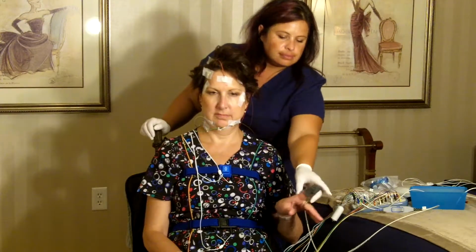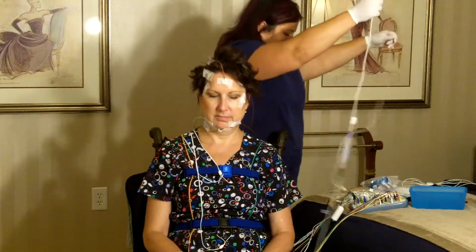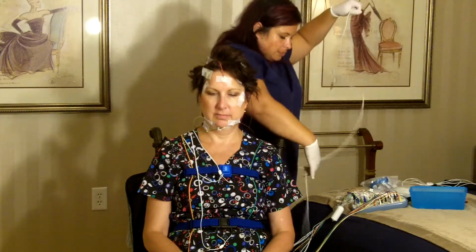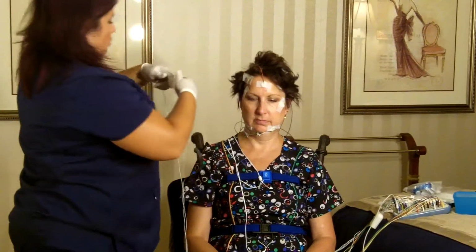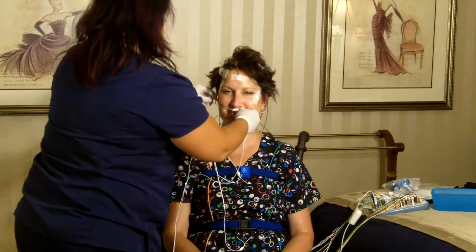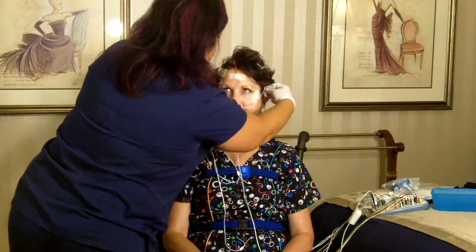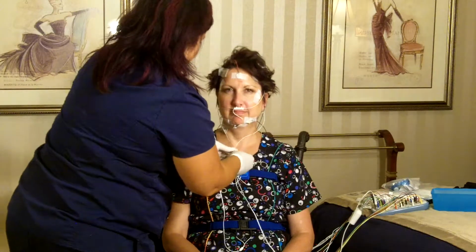A finger monitor is placed to measure the level of oxygen. For best results, refrain from wearing any nail polish during your sleep study. And last but not least, Mindy is placing two cannulas on Kayla's nose. These are used to measure airflow. Once the cannulas are in place and plugged in, Kayla will be ready to lay down and start her sleep study.